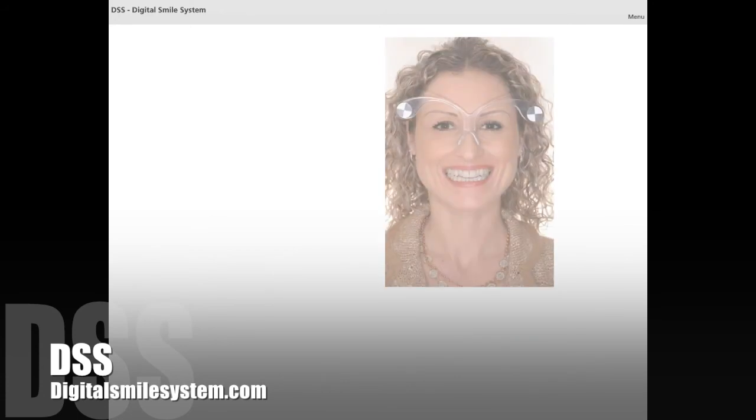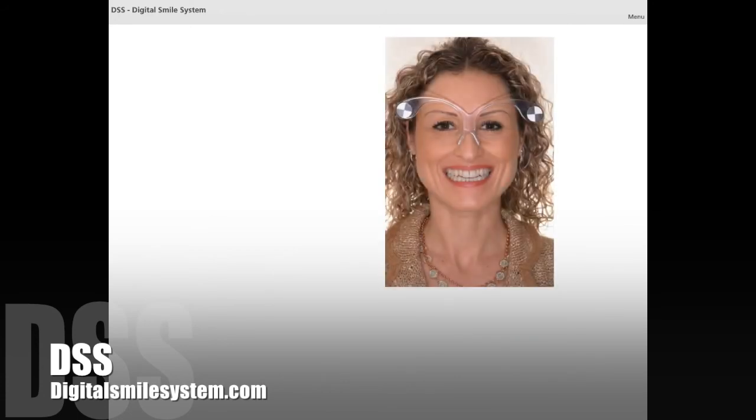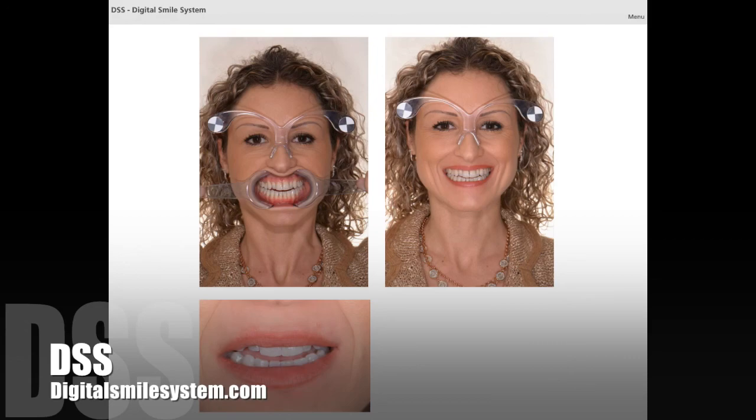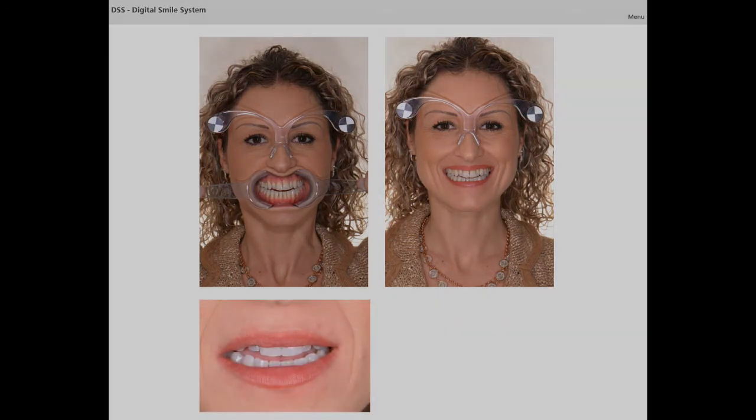Having taken the two mandatory pictures, you are now ready to create your patient's report.